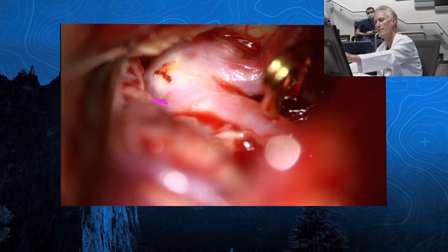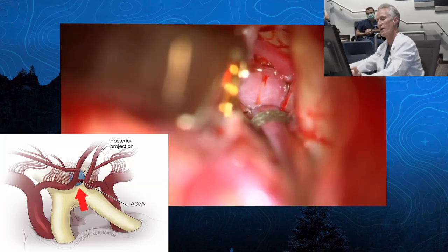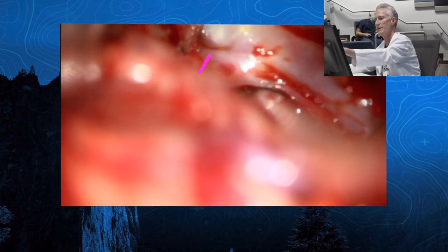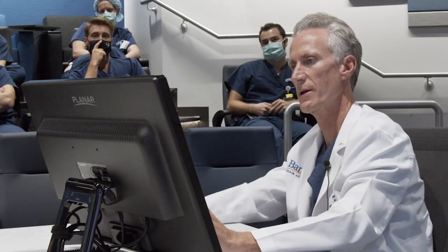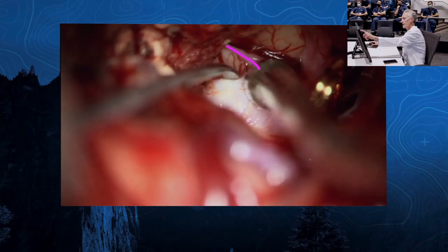So when you get a view of this aneurysm, you see it's got almost what looks like a flat front to it, pretty low front. But because we know what to expect on the backside — this is a posteriorly projecting aneurysm — we knew there was much more behind it. So that's when we decided to go with temporary clips on the contralateral A1 and the ipsilateral A1 as well. Now this aneurysm becomes nice and soft, and going behind the ipsilateral A2, the aneurysm goes all the way back behind it — much more extensive posteriorly than you would think initially. This is the contralateral A2 up here.